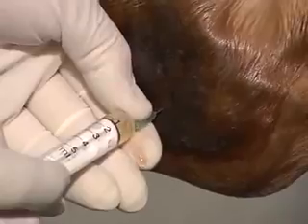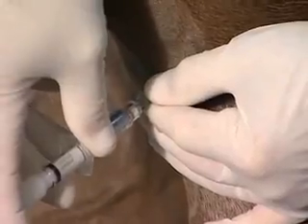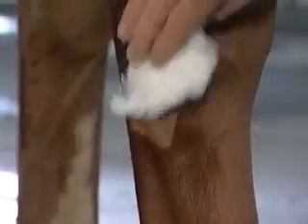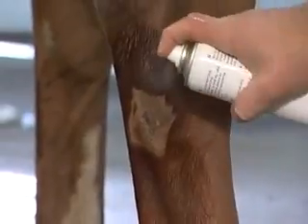When the needle has been inserted in the joint, synovial sampling and joint injections can be performed through the same needle. After arthrocentesis, the skin at the injection point should be washed once again with disinfectant and covered with spray plaster or bandage.